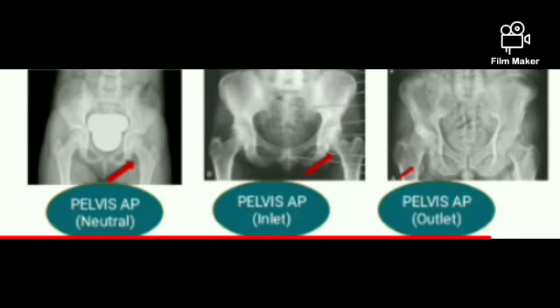The main purpose of this view is that the head of the femur and neck are seen clearly, and you can rule out any kind of intertrochanteric fractures very clearly in the pelvic inlet view. This view we will be doing for all the patients who are coming to the department, but you should be cautious if you have a trauma patient. Then you are going to put additional support with the help of a foam pad.